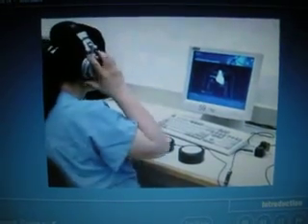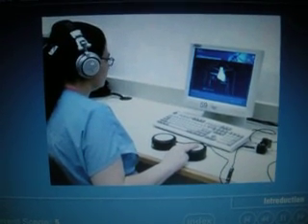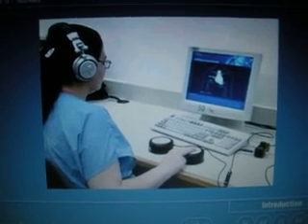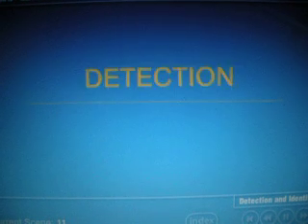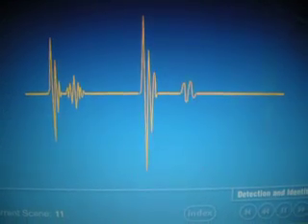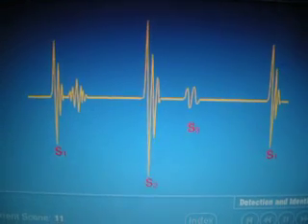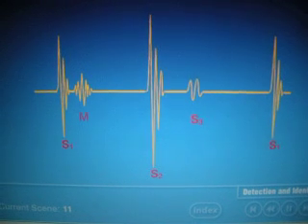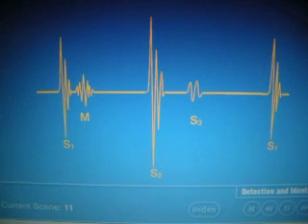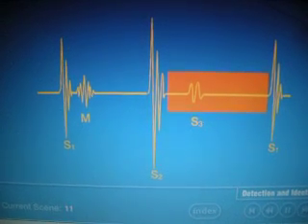Simulated heart sounds may be listened to with headphones, but the pulse must be simultaneously palpated at the pulse reproducer as if you were using your stethoscope with a patient. Detection of murmurs begins by first detecting all cardiac sounds, beginning with S1 and S2. All other heart sounds are then identified. What remains is most likely to be a murmur. One must listen selectively for an extended time to the periods of systole and then of diastole to be sure nothing is overlooked.